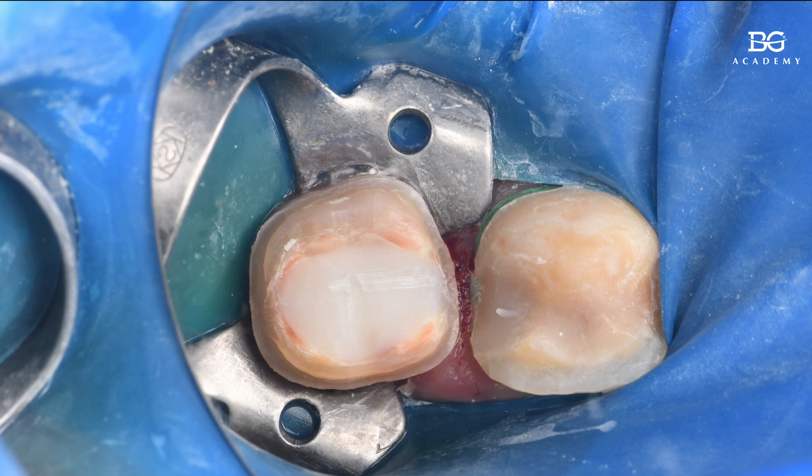Here between these molar teeth, I have a so-called split dam, which is another tip. The distal margin of the first molar was relatively deep and there was a high risk of getting the Rubberdam on the bur. So I made this type of split dam, placed a retraction cord, and made the distal margin of the first molar and the mesial margin of the second molar more clear and visible during preparation, without the risk of damaging the Rubberdam.